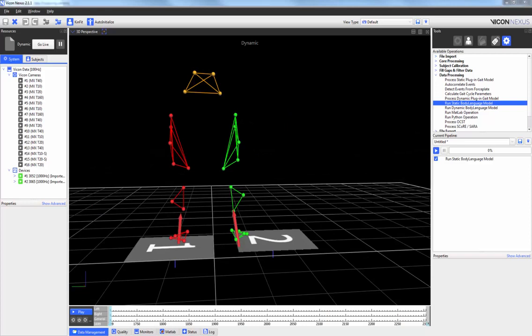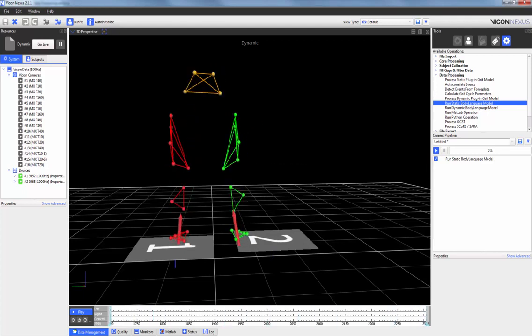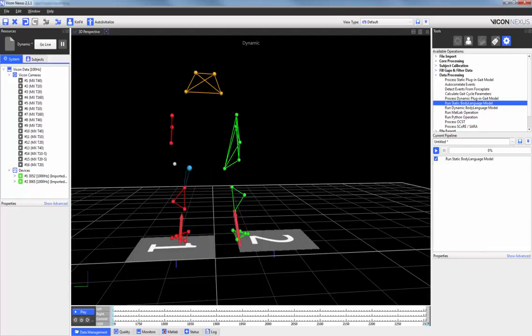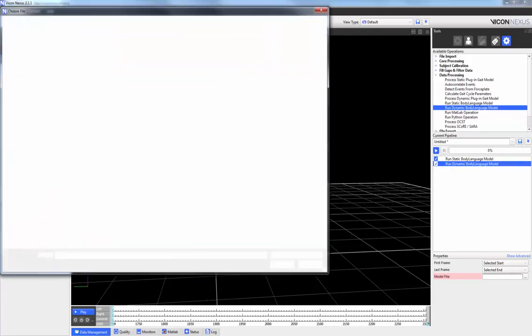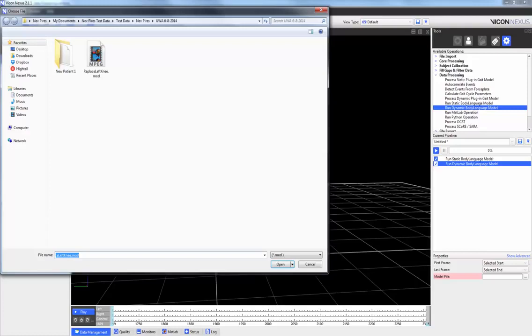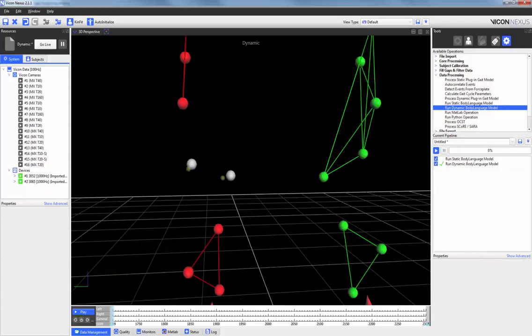After saving the static trial, I've loaded my dynamic trial, which is simply my subject squatting. I'm going to unlabel the two knee markers to show you where the modeled markers will be recreated. I'm going to add the run dynamic body language model into the pipeline and load the same model. When I execute this operation, we can see that the modeled markers have been created where the original markers were. Just like the original trajectories, we can plot and export the new modeled markers.